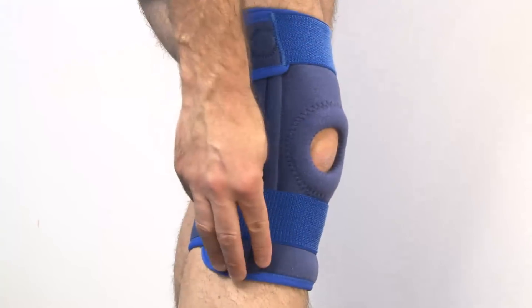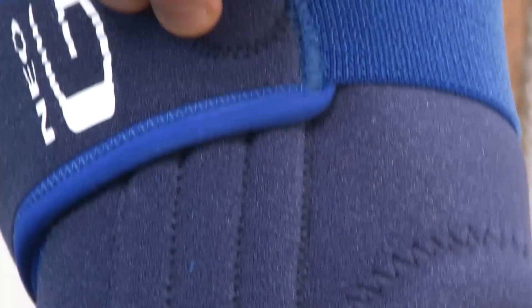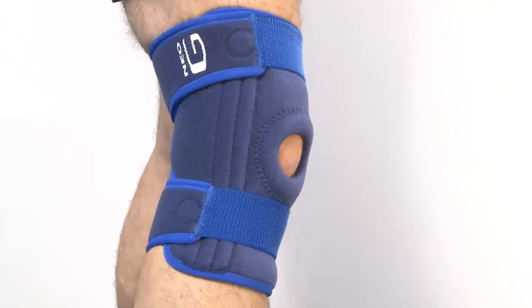It has spiral spring stays on either side of the knee to provide extra stability and support without being too restrictive.